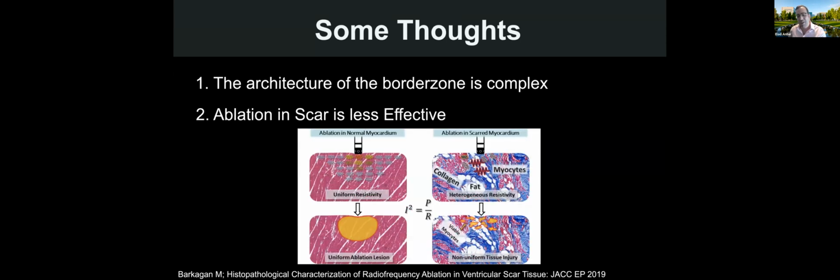Now, there are really reasons why you don't make lesions. I don't want to get into this. But this slide I wanted to show, following what John was saying, is to address also the question about how to pace. In an ideal world, and that's what I'm working on now, we will have some kind of a grid that we can just place. And when you're going to a discotheque, everything is going to be, I don't go to a discotheque for 30 years, I can't even dance, but if I could. You can pace each one of them separately, automatically. And you can reduce the artifact. You can apply a negative current to basically desaturate the rest. So you can stimulate each one of them and measure from the rest.